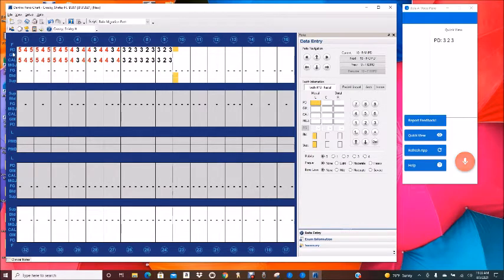Furcation grade 2 on tooth number 2 buccal. Mobility +3 on tooth number 3. Bleeding on the mesial and distal of tooth number 2. Bleeding all tooth number 3.